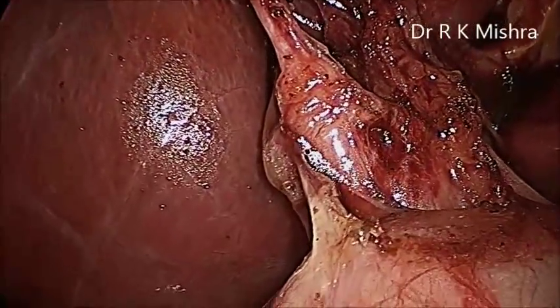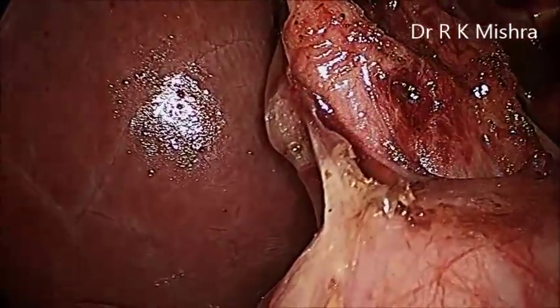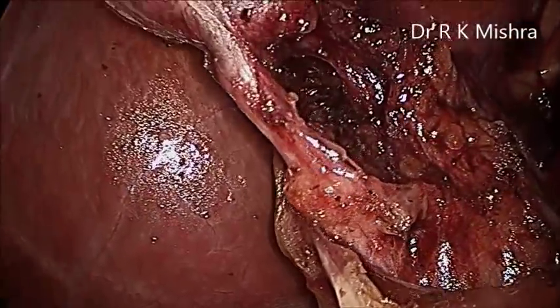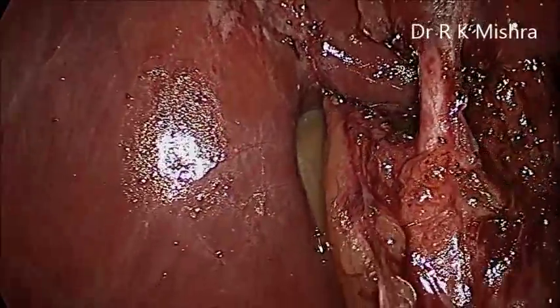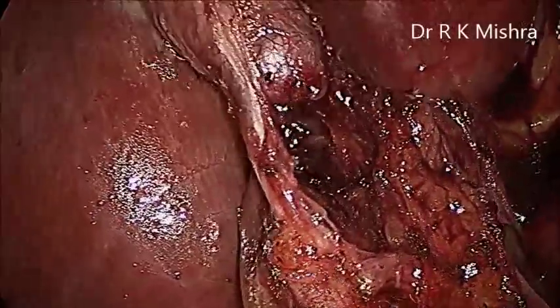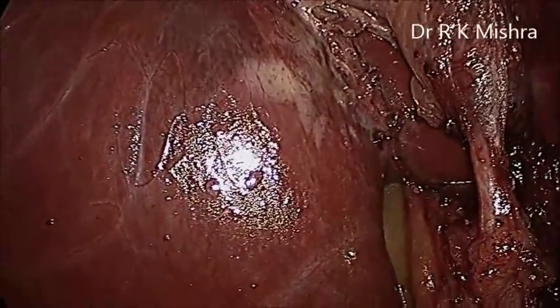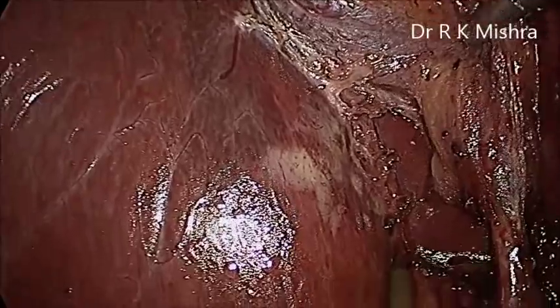So we will take the extracorporeal knot here. The time is taken to prepare the vicryl number 1 and feeding the vicryl into the Bhandarkar knot pusher, which will be used here. And number 1 vicryl. So this is just a waiting time for the knot to come.